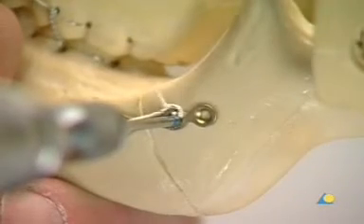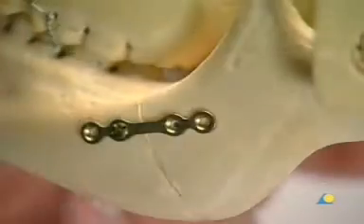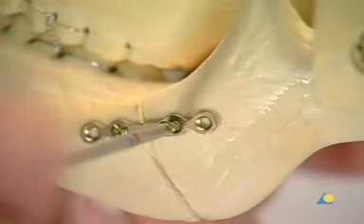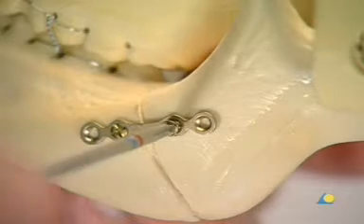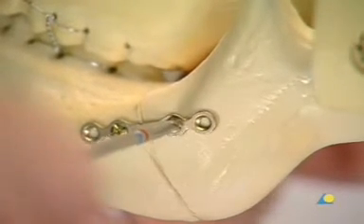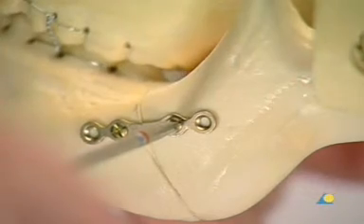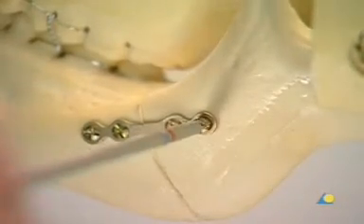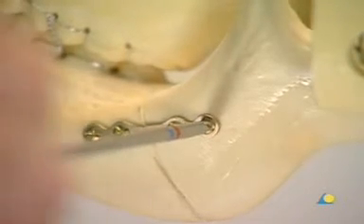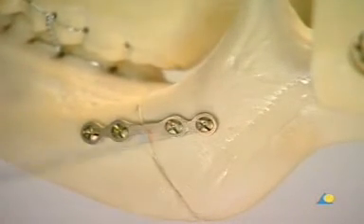The second screw is put in on the opposite side of the fracture line, using the same technique. The remaining screws are inserted. Every screw is then securely tightened.